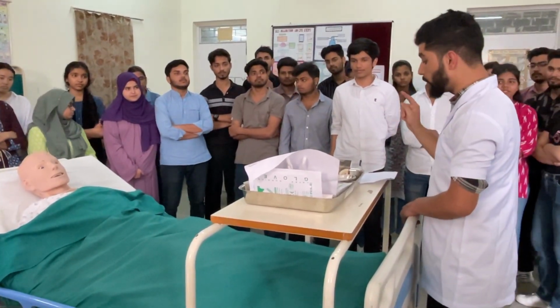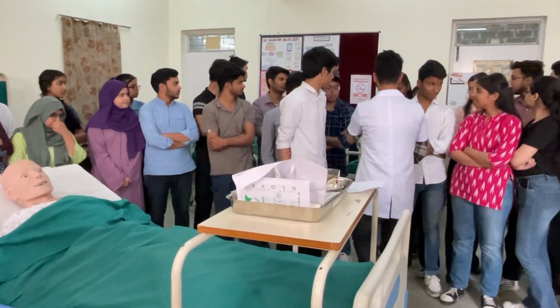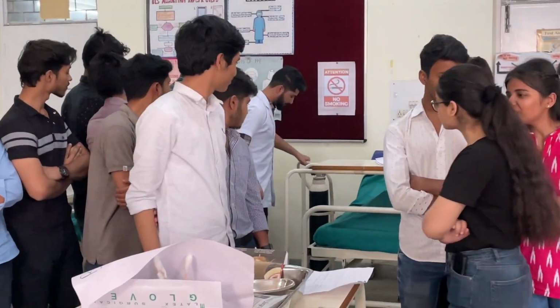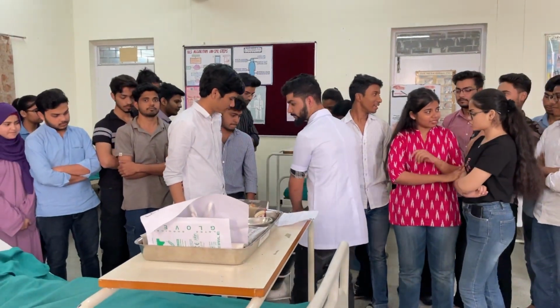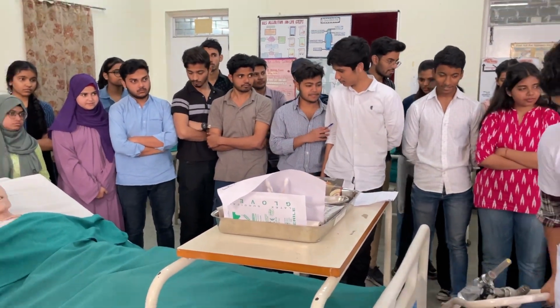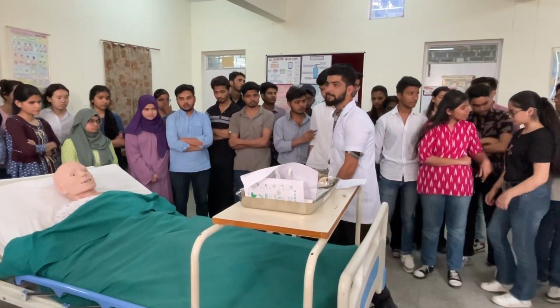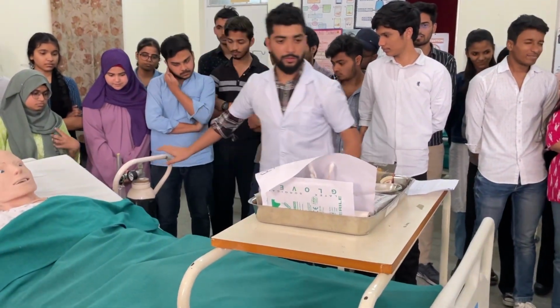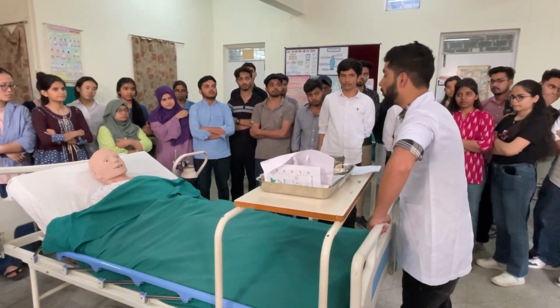The third instruction is don't use oil on the oxygen cylinder. This one is the oxygen cylinder. Keep it on the left side, because the logger is kept on the right side, so you can keep it here. Don't use oil on the oxygen cylinder.